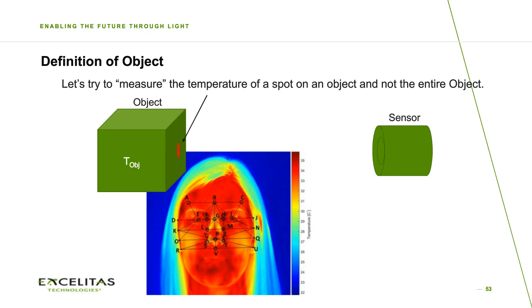No, you cannot measure it. You need to measure it from the front, from the side. And then if you want to have a long distance measurement, then of course, the longer the distance, the smaller the pixels must become. So we need more pixels to actually measure this one. I've seen devices on the market which are nicely performing in such a case with a very high pixel resolution.